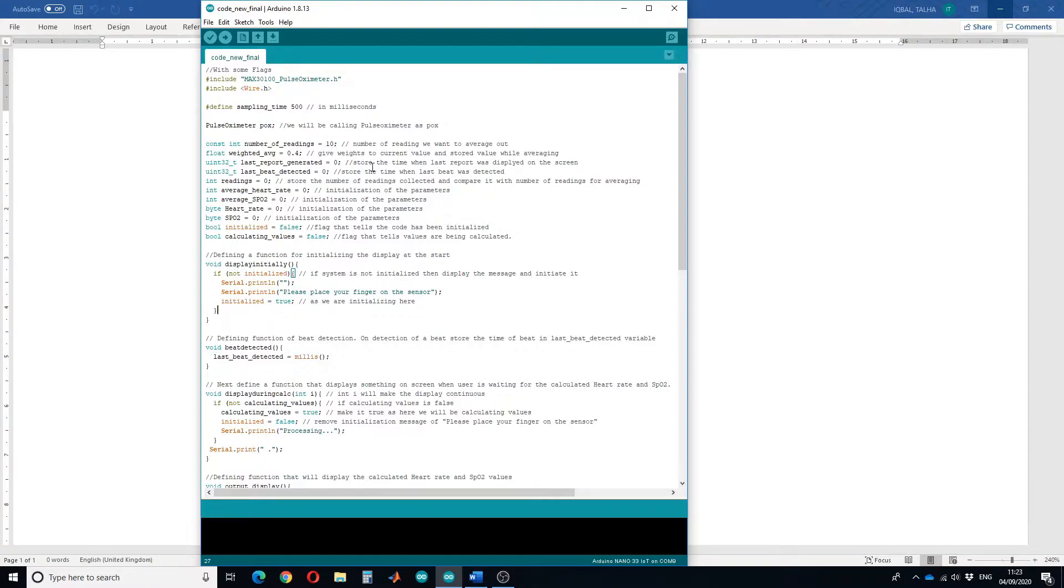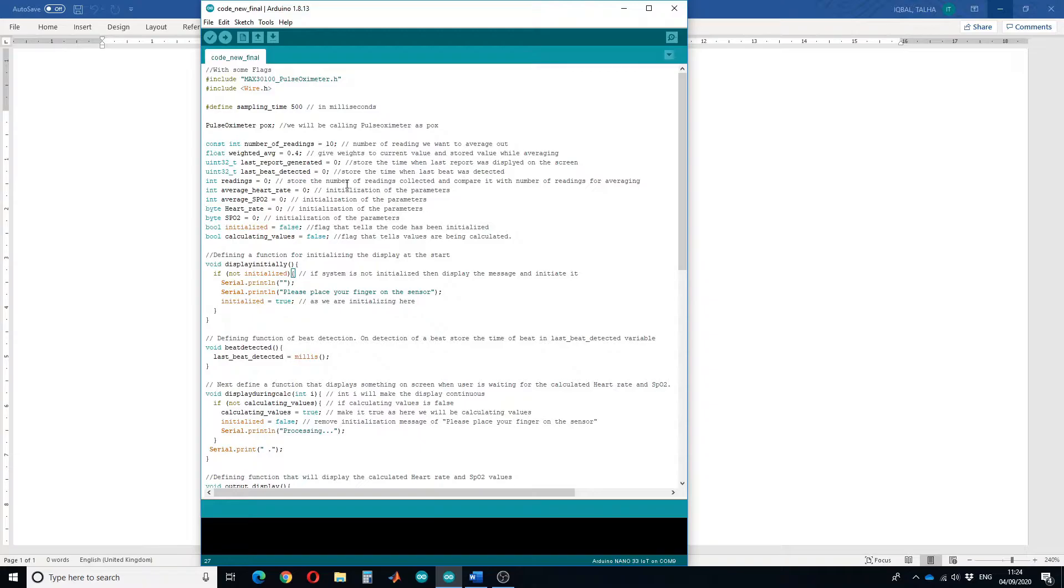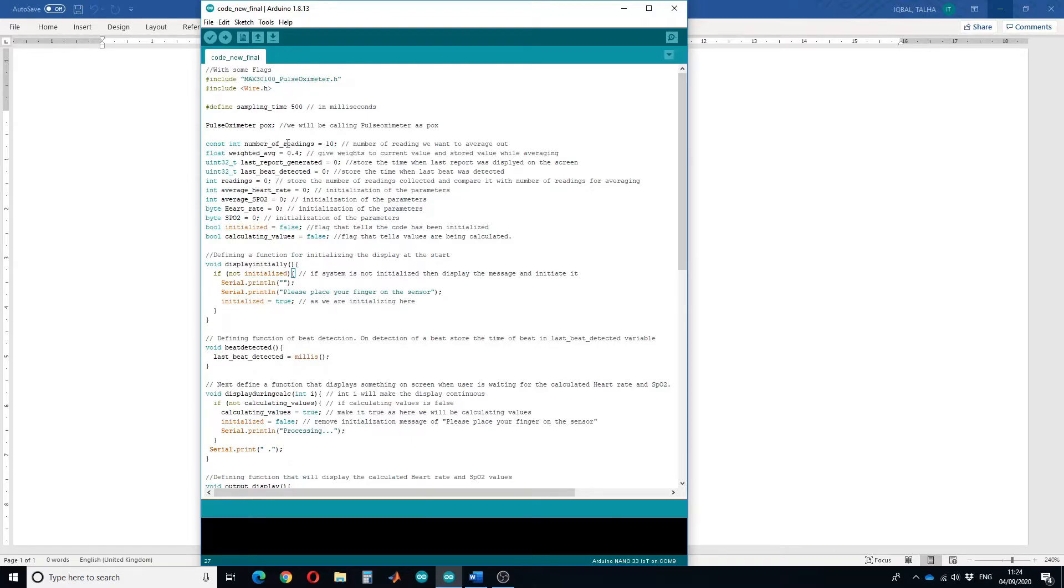Then I have defined a variable that will store the time when the last report was generated. Last beat detected will store the time when the last beat was detected. Readings will store the number of readings collected and compare it with the number of readings for averaging.